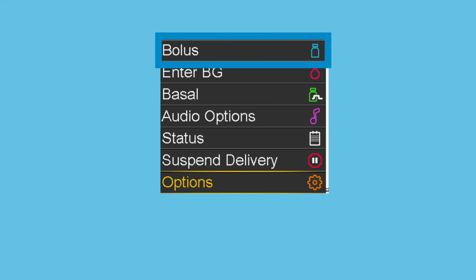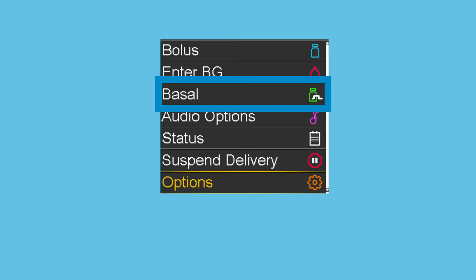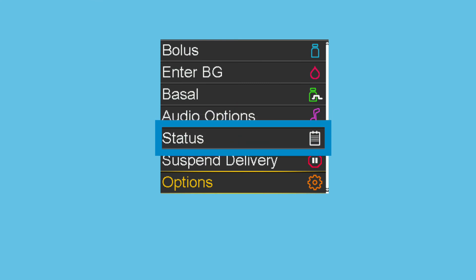Delivery settings can be accessed on this menu. The Enter BG option allows a BG reading to be entered manually. Basal gives the option to switch over to a temp basal or a preset temp basal rate, or change to a different basal pattern; this option also gives access to delivery settings. Audio option is where to set how to be notified of an alert or notification, either with an audio alert, vibrate, or both; the volume and alert silence screen can also be accessed. The Status option shows information on auto mode readiness, notifications in the last 24 hours, quick status, pump status, sensor status, and the settings review.